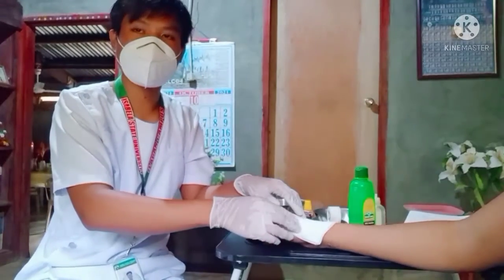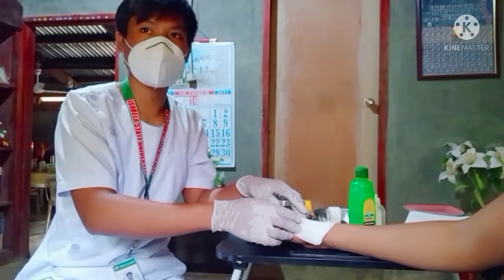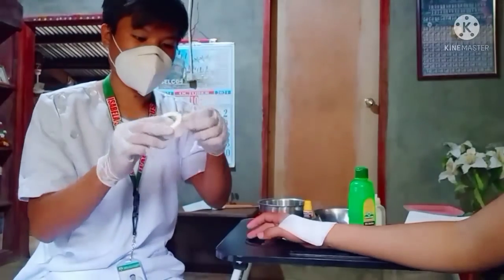Apply the sterile dressings one at a time. Use tape or rolled gauze to hold these dressings in place. This is the tape.